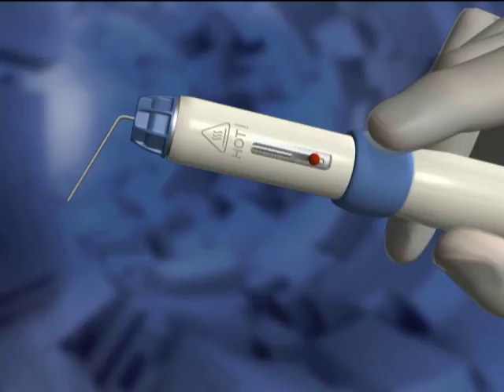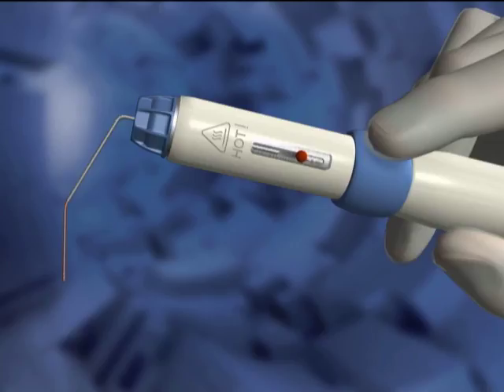Light pressure on the blue activation cuff will start the plunger moving forward and begin the flow of gutta-percha. Releasing the pressure on the activation cuff will cause the plunger to pull back ever so slightly and cause the flow of gutta-percha to come to a stop.